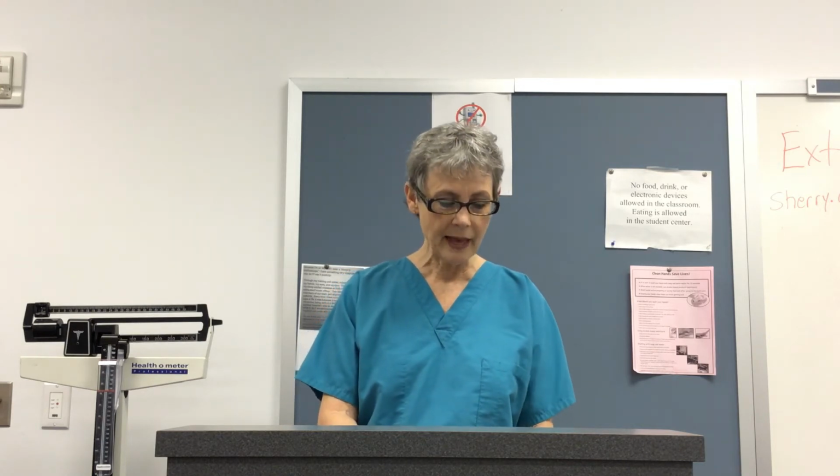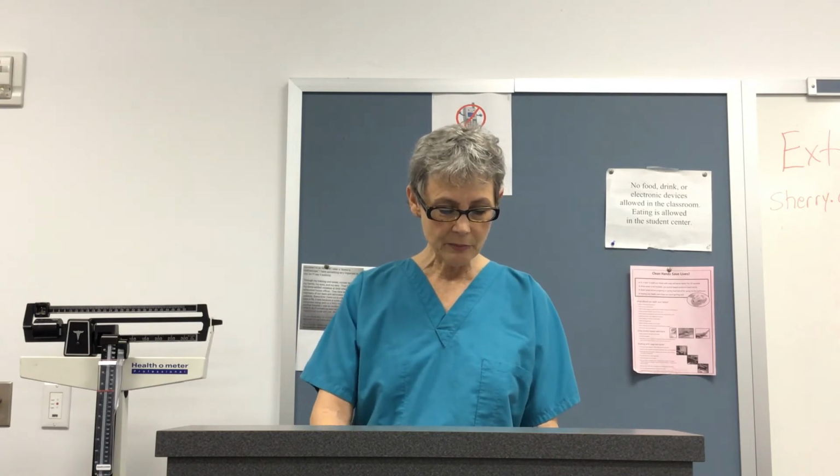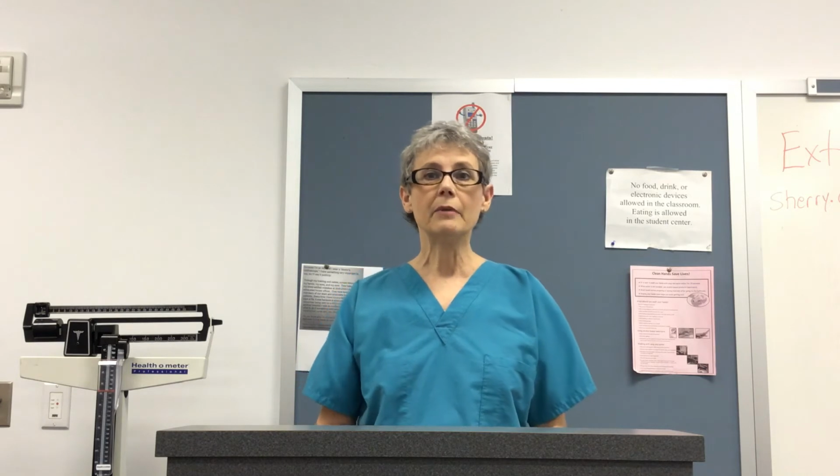The next section on your handout is talking about discontinuing an IV, but again, that's on the video. So let's move on and talk just a little bit about IV meds. Of course, administering an IV med is a high risk to patients, because that medication is in the vein immediately.